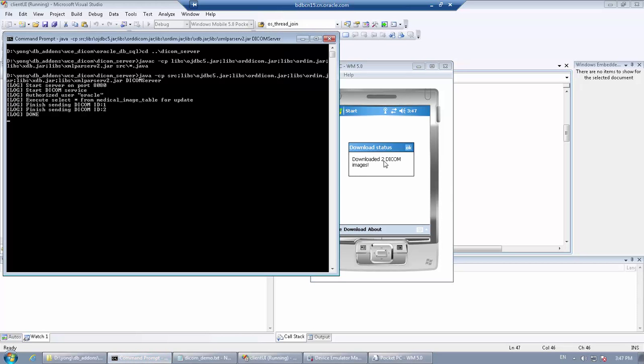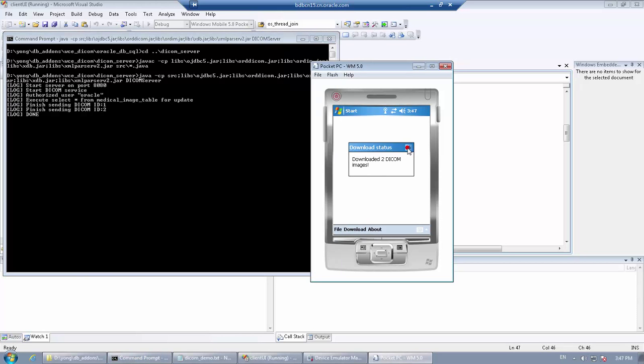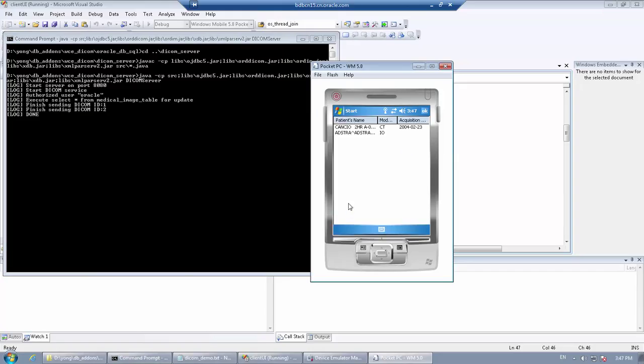Now we see that we have successfully downloaded two DICOM images from the application server. We can also open them to see the DICOM attributes.